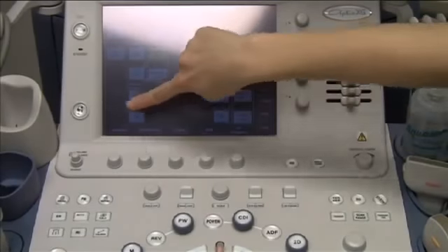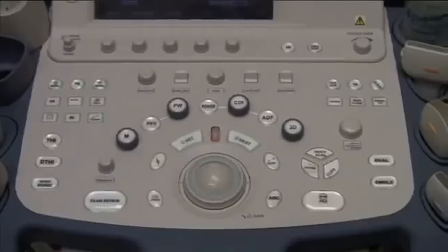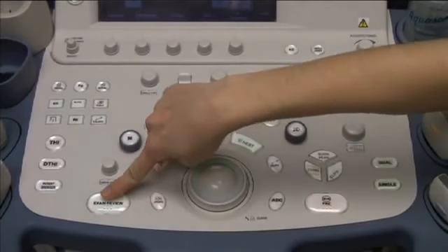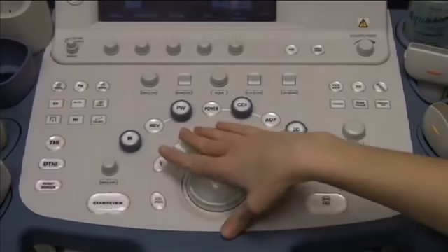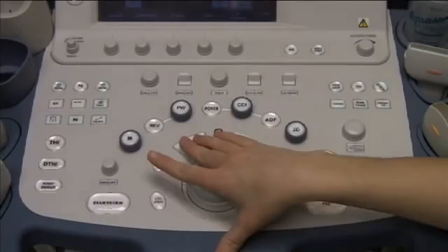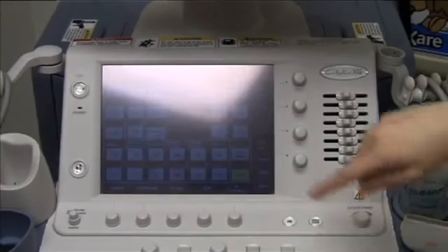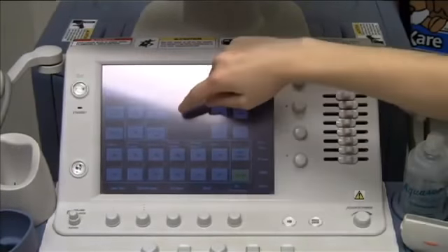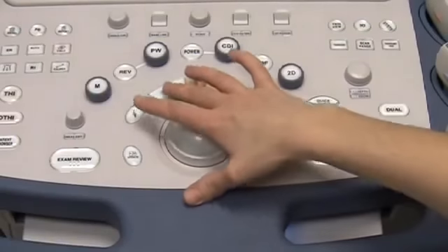To end the study, press the Patients button. To review images that you have scanned and stored, press the Exam Review button — it will illuminate. To exit the Exam Review function, select Quit at the bottom of the screen. To power off the machine, press the Power button, then select Shut Down using the trackball and set.